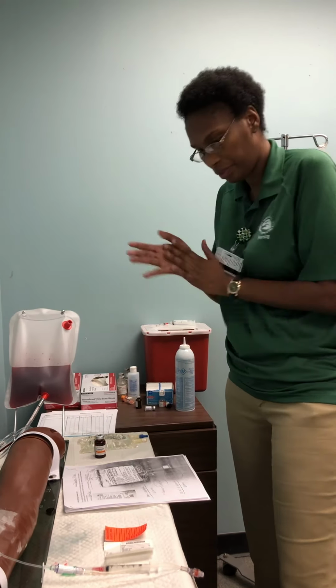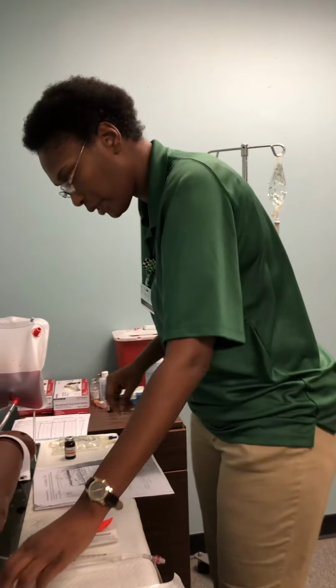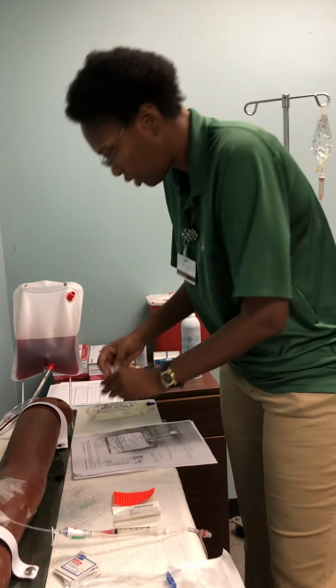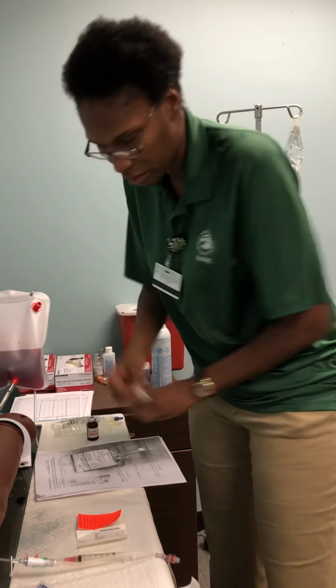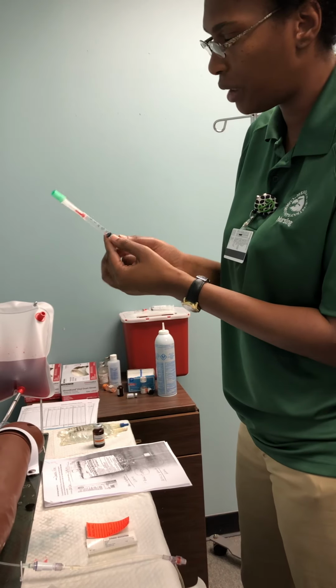I'm going to start with the Lasix. Clean the valve for 30 seconds. And I'm going to inject 3 mLs of air.